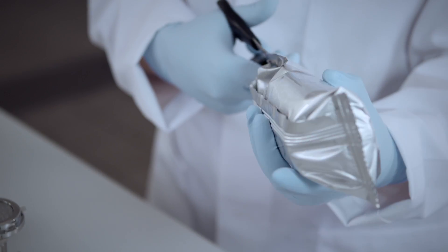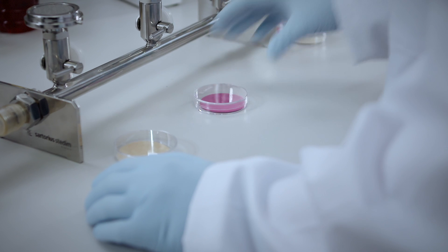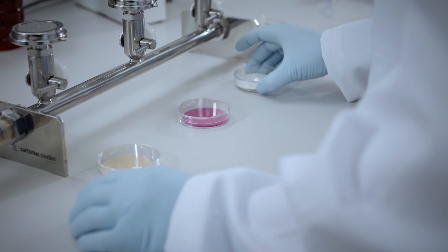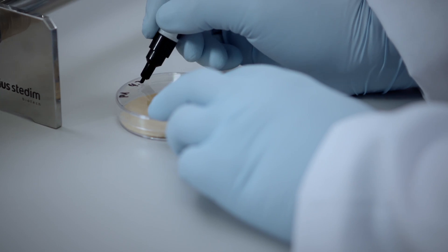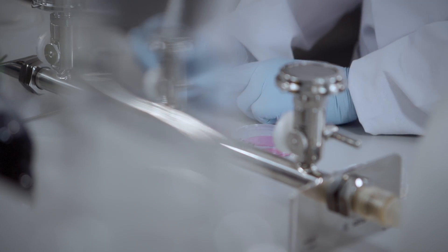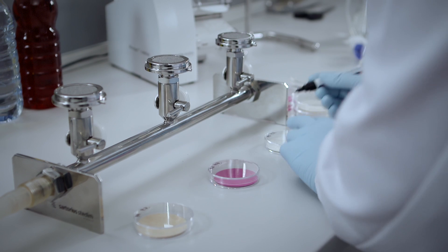Nutrient pads are ready-to-use sterile dehydrated media. The special packaging protects the sensitive formula constituents of the nutrient pads during transport and storage from fluctuations in humidity and temperature. As a result, the high quality of our MPS can be guaranteed throughout their entire shelf life of 24 months at room temperature, thus saving you space in your refrigerator and the need for additional equipment in your lab.